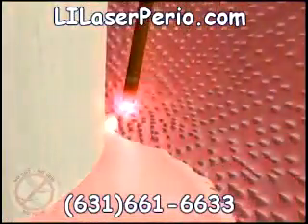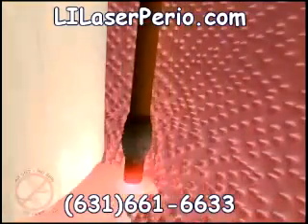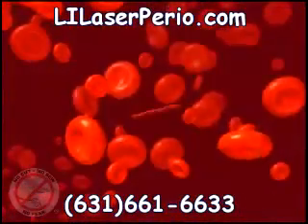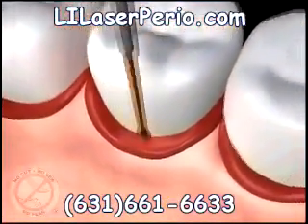Then the laser is used again at the bottom of the pocket to remove any remaining diseased tissue. This pass of the laser also sterilizes the tissue and bone and completely eliminates the bad bacteria, germs, and toxins. It also stimulates the formation of a blood clot, which once formed contains fibers that reattach your tissue to the tooth surface and seal out debris and bacteria like stitches would, and creates the right environment to cause the bone and other soft tissues lost from the disease to grow back.